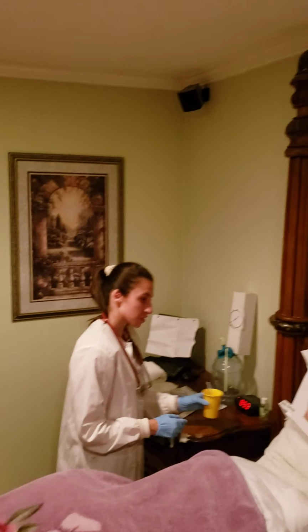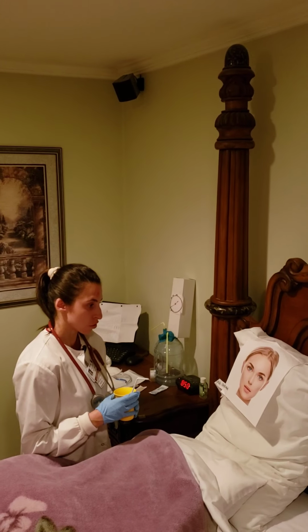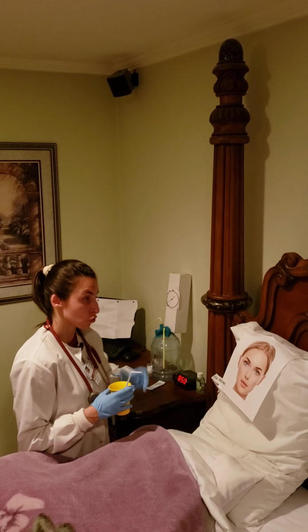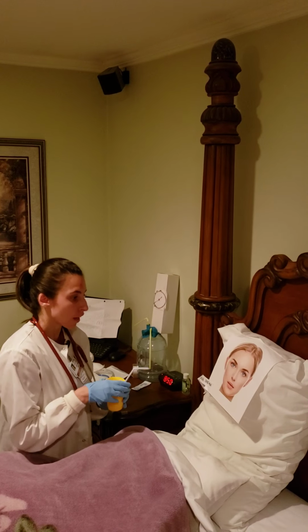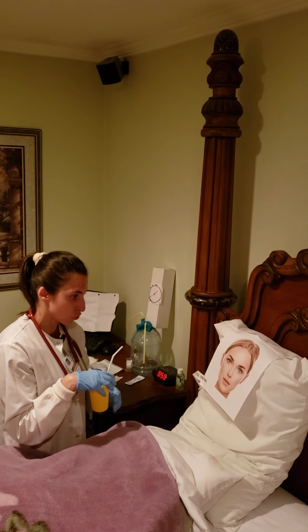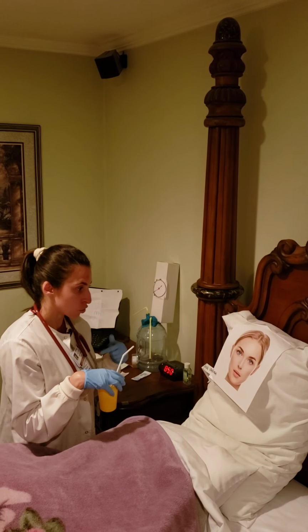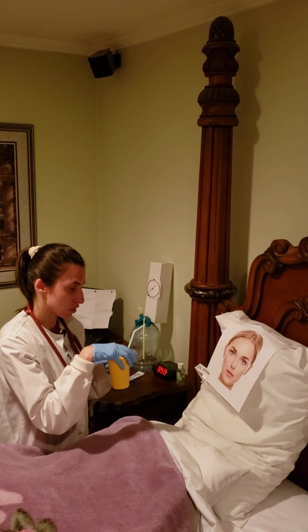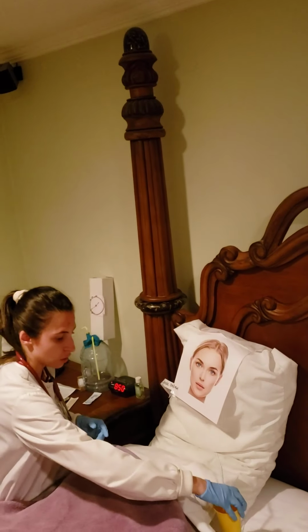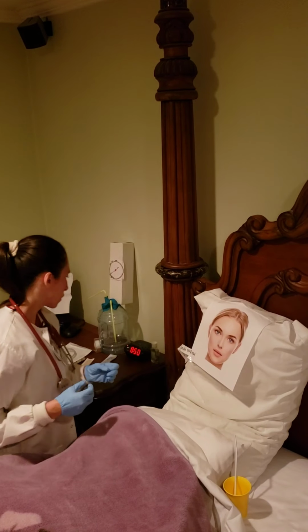So now, Ms. Carmel, this is where you're going to help me in this procedure, okay? So when I first insert the NG tube, I want to have you look up to the ceiling, okay, like this. And when I start to insert the NG tube further into your nose, I want to have you point your head towards your chest like this, and I want you to take sips of water. Can you do that for me? Yes? Great. So I'm going to place this near you so you can reach it.